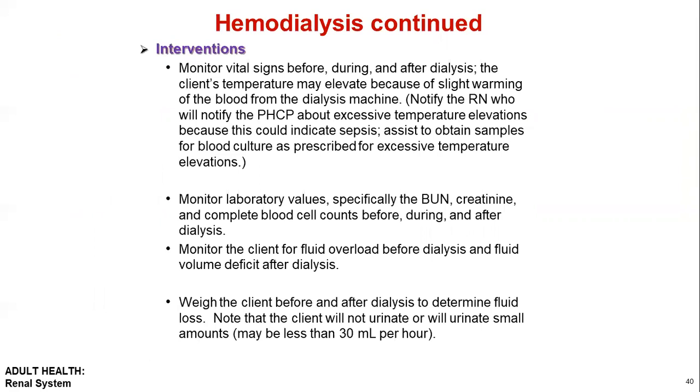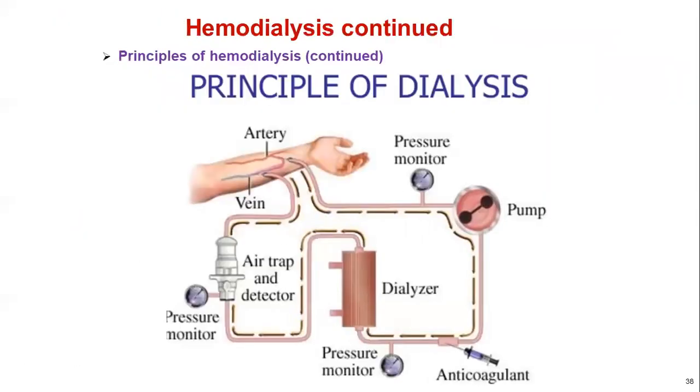As I told you at the beginning, before starting the procedure, we ensure the patient's vascular access is working well. Let me show you the picture. Before starting this process, we check whether this artery is working well or not.